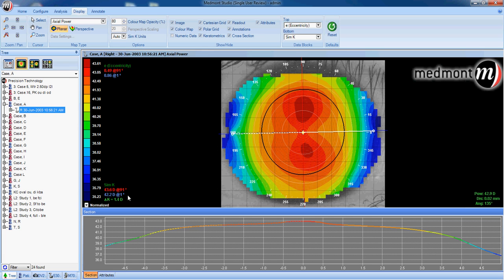We can see with simulated K readings the flat axis is at 1 degree and the steep meridian is at 91 degrees. We can see we have 1.4 diopters corneal cylinder, with the steep meridian running vertically and the flat meridian running horizontally.